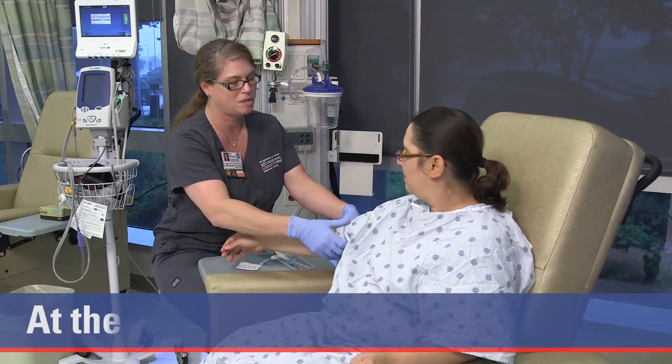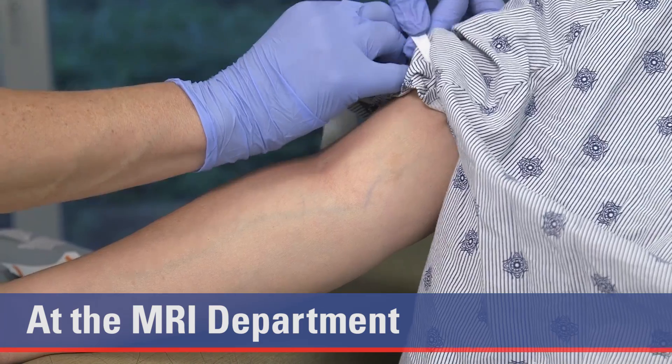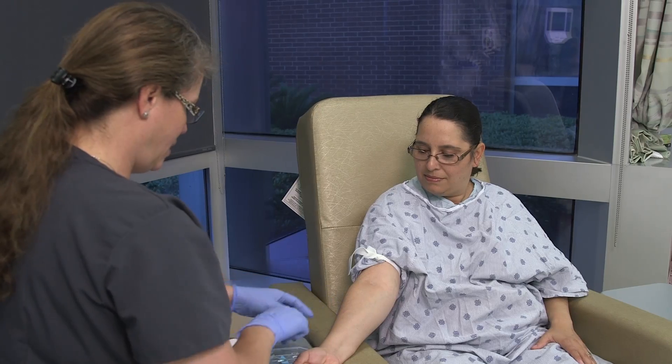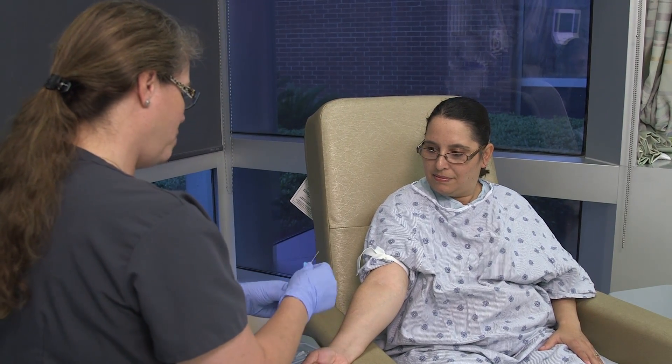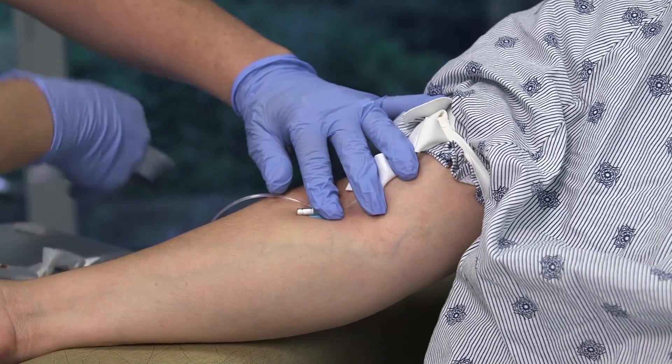In preparation for the MRI, a nurse or technologist will insert an IV into your arm. This will be for the contrast dye given during your exam. The dye will enhance the images. Tell your doctor if you are allergic to any type of contrast. Also, let your doctor know if you are pregnant or nursing.